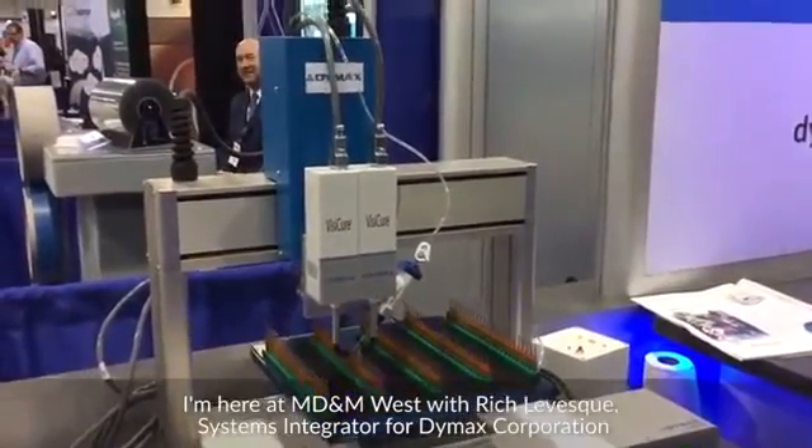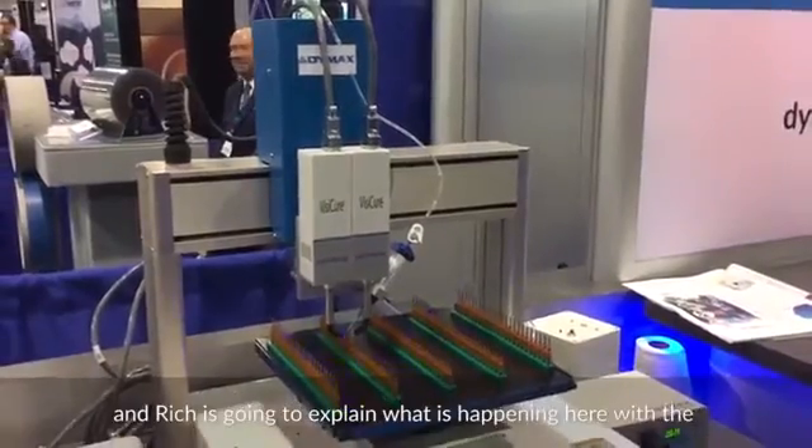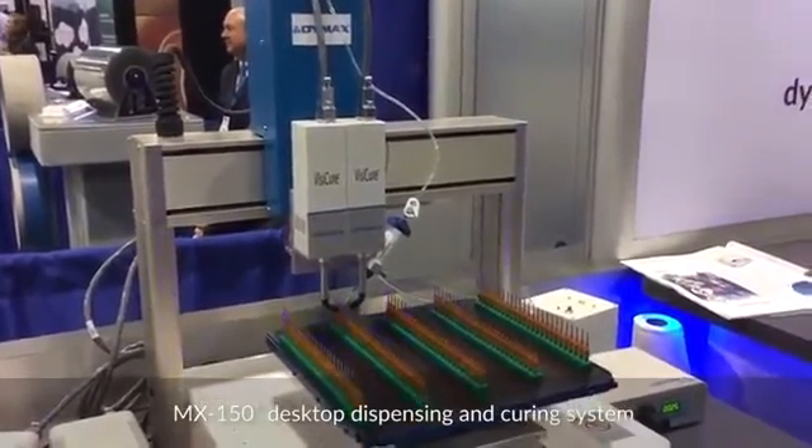I'm here at MD&M West with Rich Levesque, Systems Integrator for Dymax Corporation. Rich is going to explain what's happening here with the MX150 desktop dispensing and curing system.